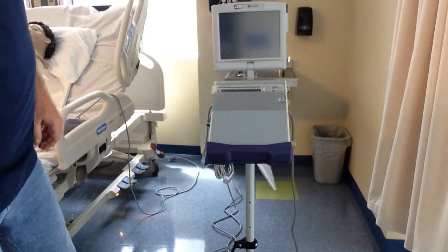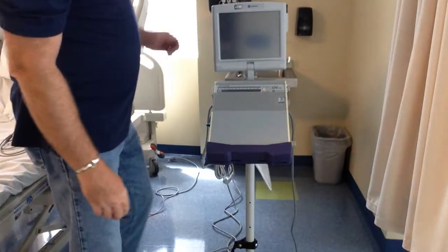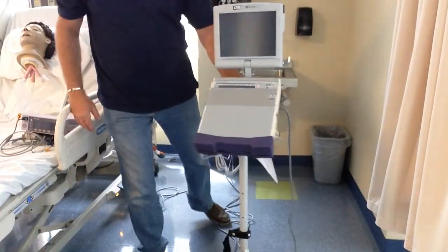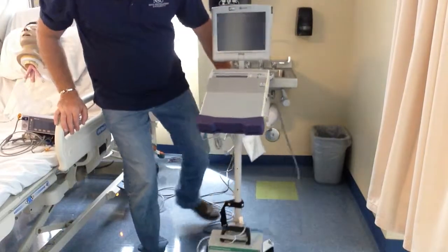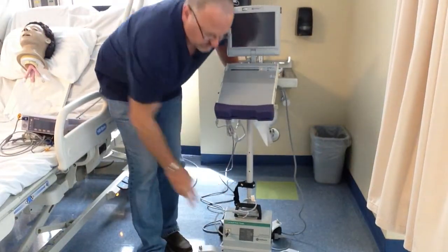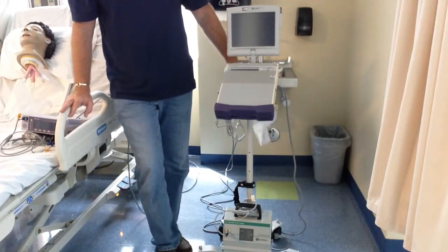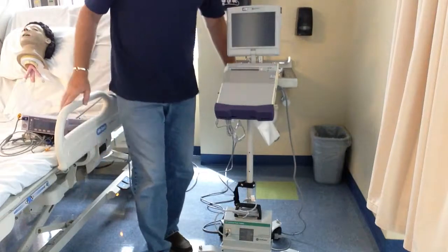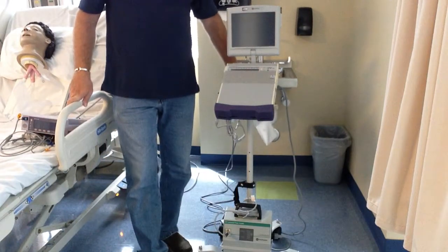We're going to start with the LTV1200 ventilator. This is a portable transport ventilator. If you have them on a stand like this, the item down here is an external battery. You can get four to five hours out of this. You have a percentage LED light that tells you how much of a percent charge this battery has.